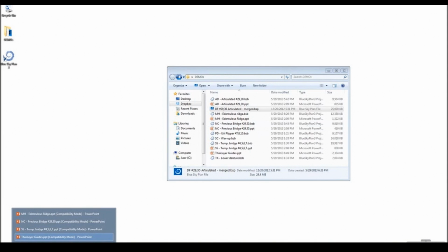We cone beam scan all of the stone models. The advantage to that is that you have no scatter. We use a scan appliance in order to orient the stone model to the patient scan. And so you have to make a scan appliance with fiducial markers on it, and the patient wears that while they're scanned, and then that scan appliance is placed on the stone model, which we or you scan, and the merge is on the basis of those fiducial markers.